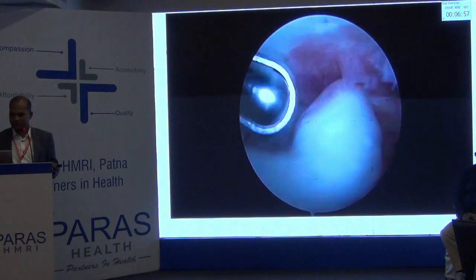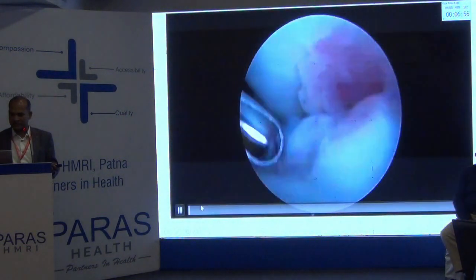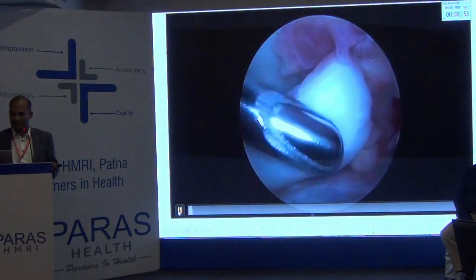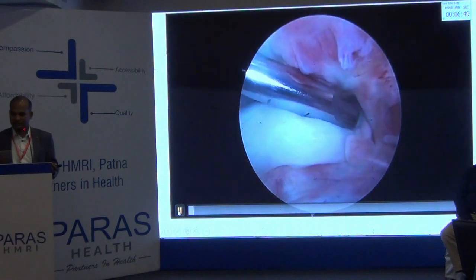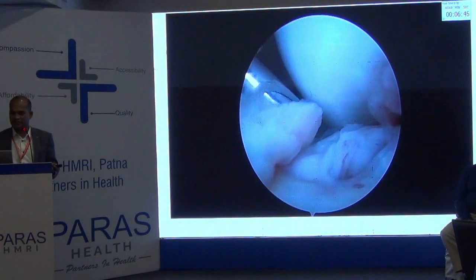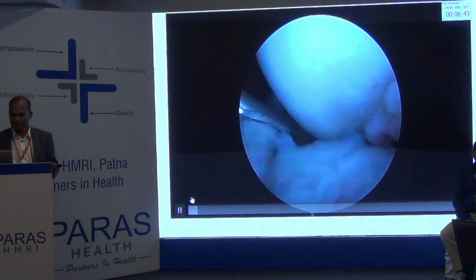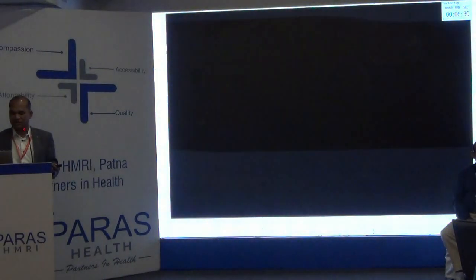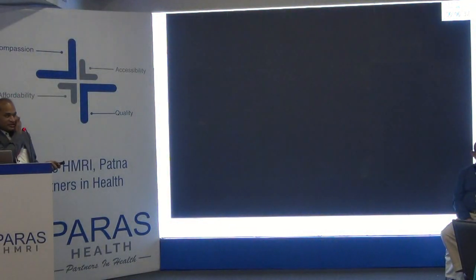You can see here the double bucket handle is there, and this is at 8 weeks. The reduction is a little bit difficult. And this is the remaining peripheral part. So, Sunit boss, an 8-week-old injury, this is the quality of tissue, in a 22-year-old male boy, with an associated ACL tear.